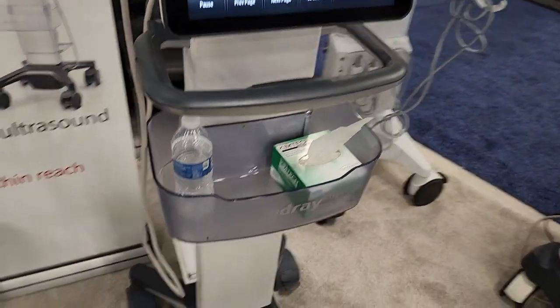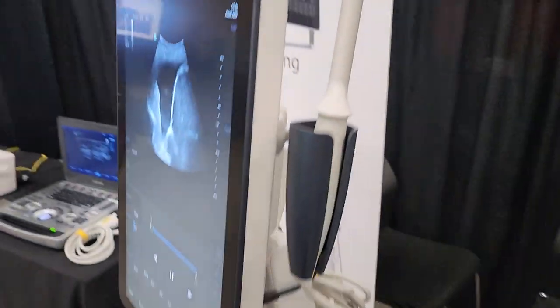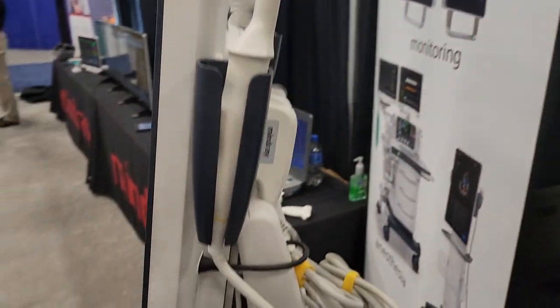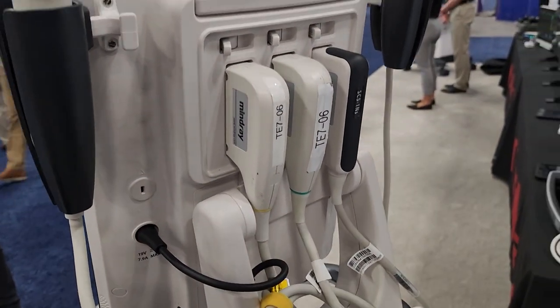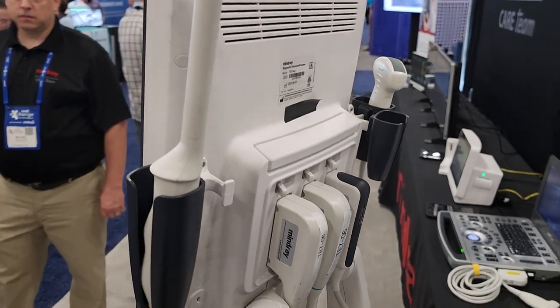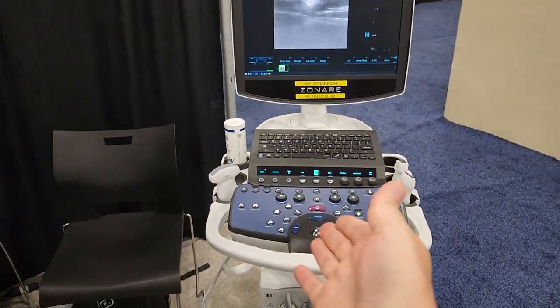When I talk about design choice, guys, it's all about sleek and intuitive design — nothing that's unnecessary. Looks like you've got three different probes that can connect on it. Beautiful machine. This is the one that caught my eye the most.